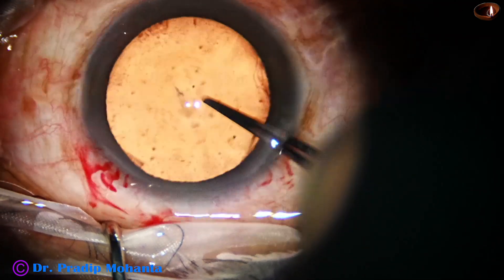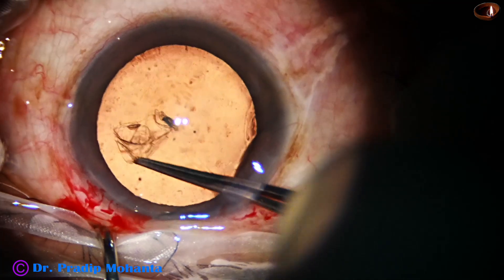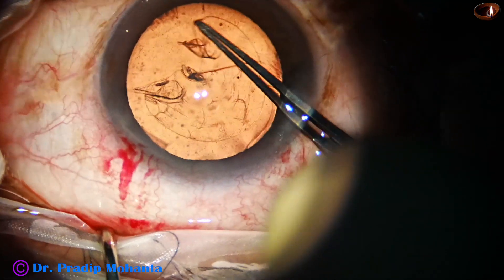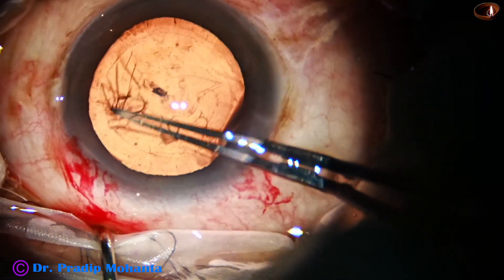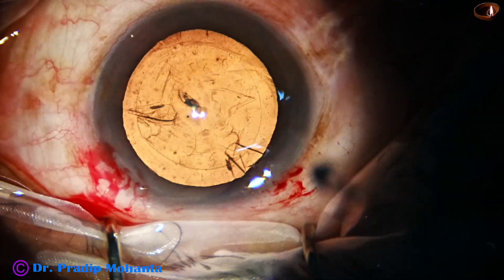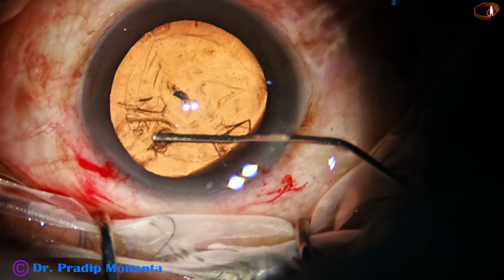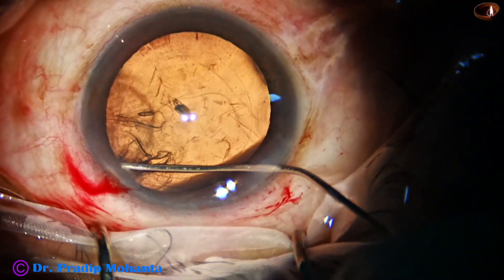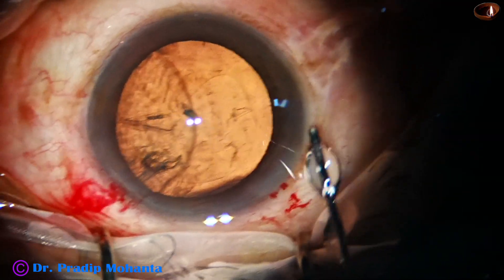Now capsulorhexis is being done with the help of a Utrata forceps. For the lens tilt technique, the size of the rhexis should be about 5.75 to 6 millimeters, because one part of the equator is to be prolapsed out of the capsular bag. If the rhexis is very small, it will not prolapse.